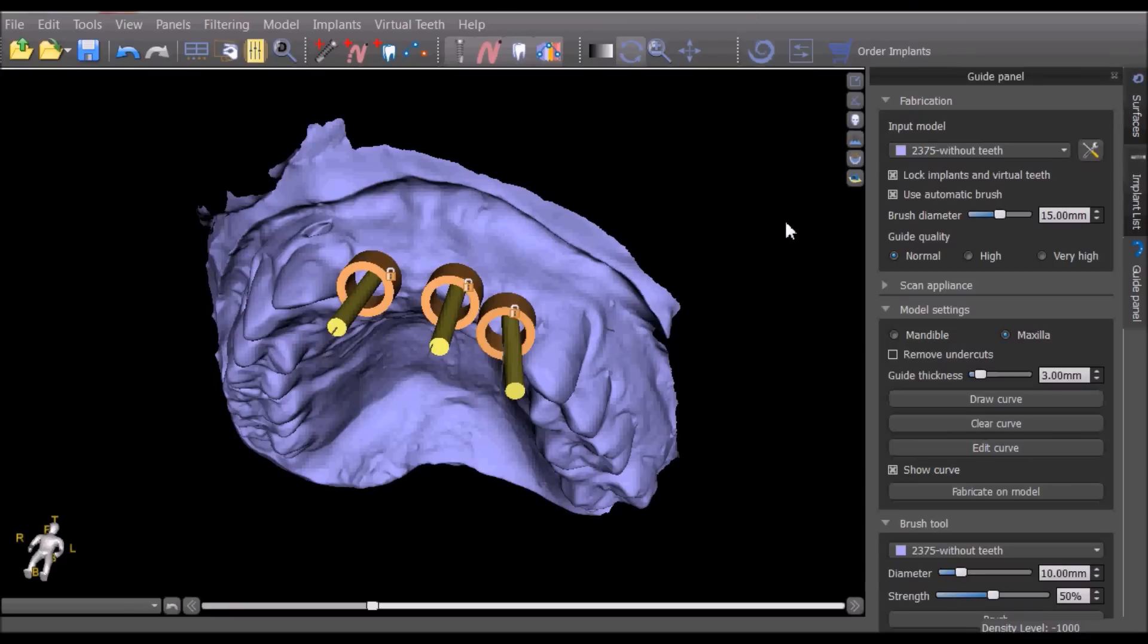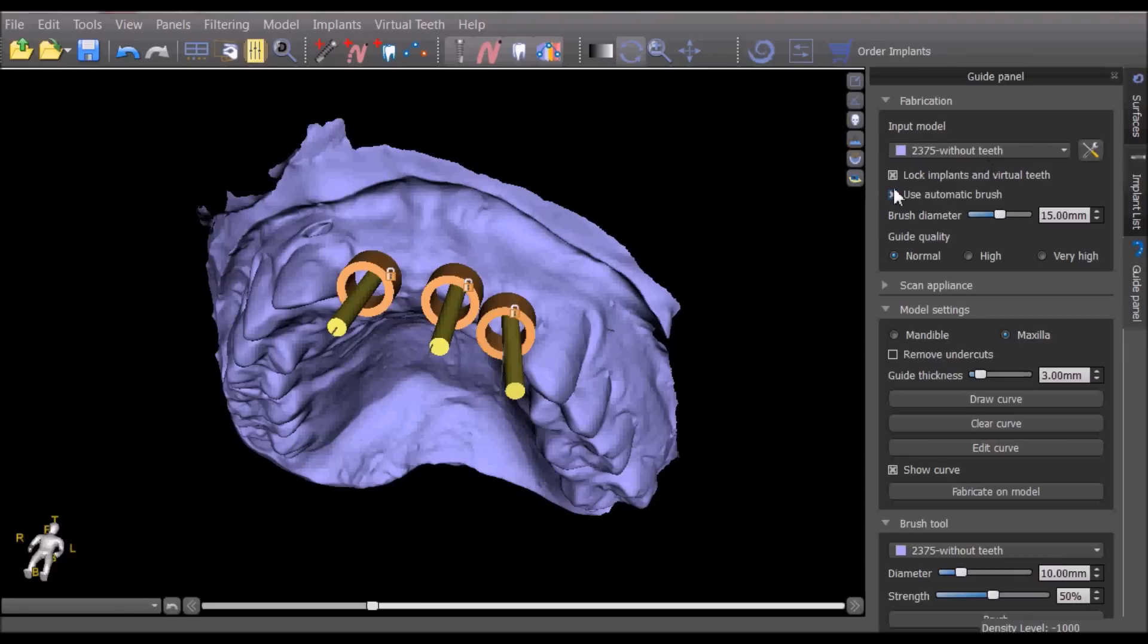Start fabricating the surgical guide by confirming the relevant model appears in the drop-down list. Select lock implants and virtual teeth to confirm that the implants and virtual teeth are not moved accidentally during the guide fabrication process.